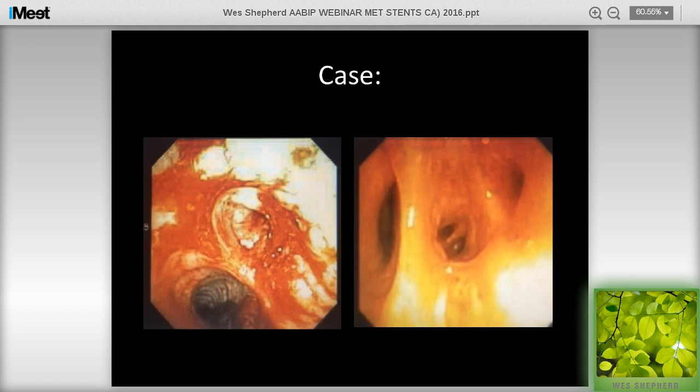looking at now. So our patient went on to have bronchoscopy, and as you can see here, the left main bronchus was fairly patent. The right main bronchus was nearly completely occluded by endobronchial tumor and also extrinsic compression. So the patient had both findings. We were able to pass a small flexible scope past the obstruction and visualize distal airways, the middle lobe and lower lobe and superior segments, and see that they actually look similar to what we saw on the CT scan, and that they appear fairly patent.